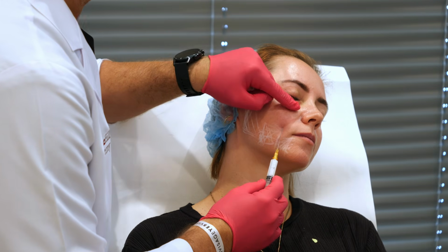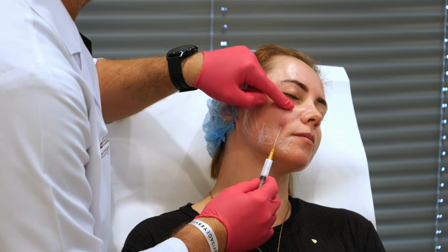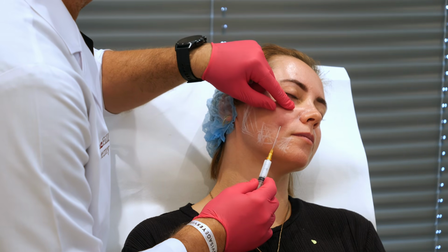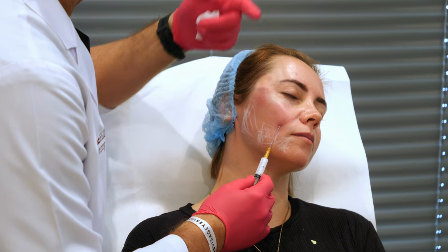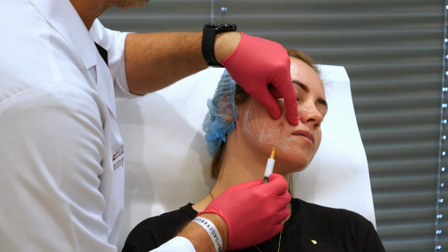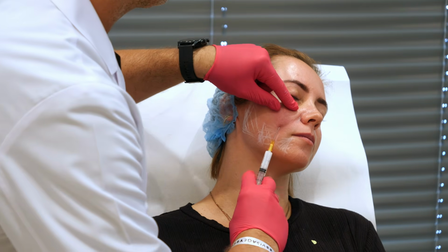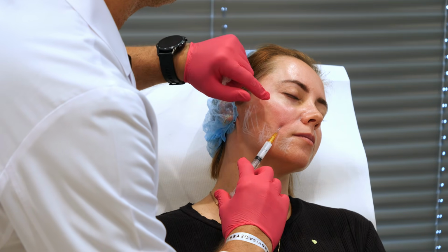I prefer to first correct this loss of volume because of time, a little bit of the lift effect from here, and not so much correction in this zone. I go slowly to make the treatment comfortable. Okay, you can see it.